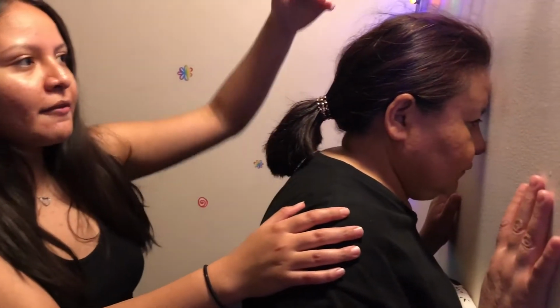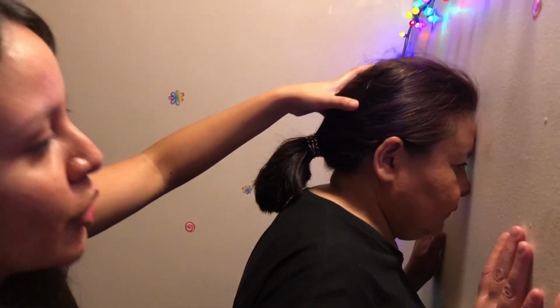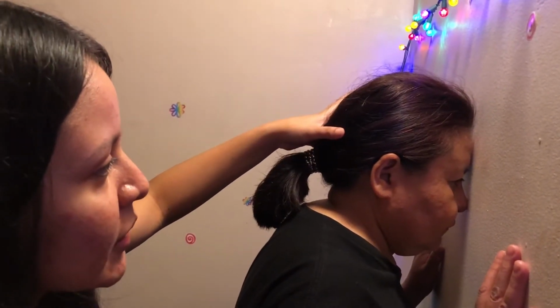This is the PA projection of the skull, and we're going to be operating at 40 inches SID. We're going to have the patient position be erect or prone, and we're going to have the patient's forehead and nose leaning up against the wall bucky.